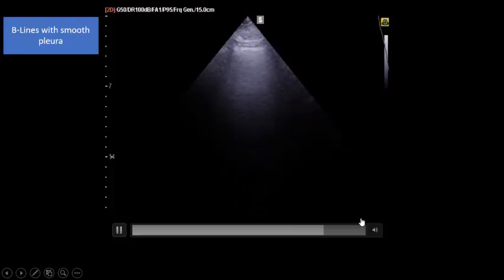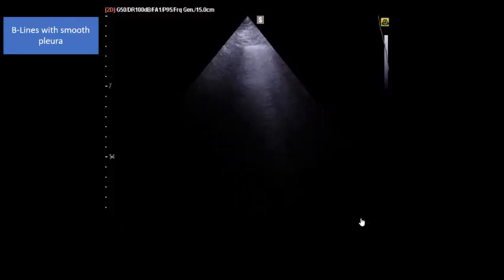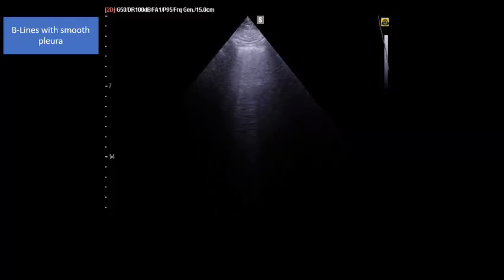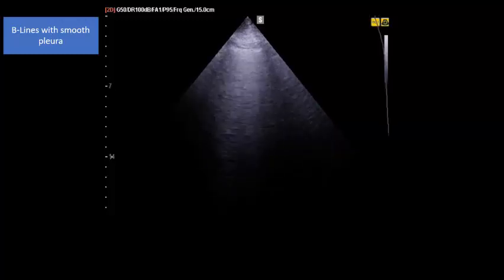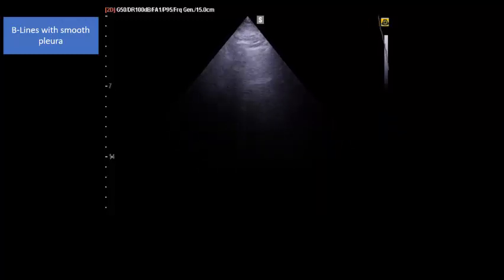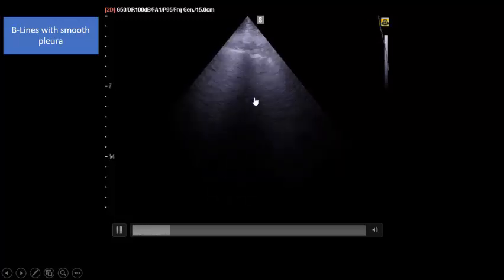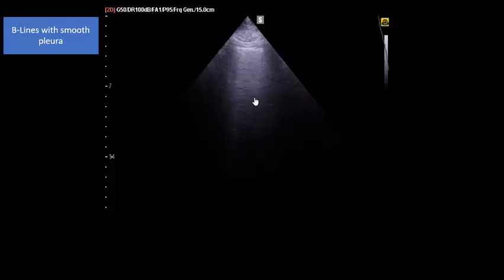As you see, advanced critical care ultrasound is magic, and this is the way you need to follow if you need to do your logbook for advanced critical care ultrasound certification. You need to go in this sequence in cases of acute respiratory failure. You go beyond the pathogenesis to diagnose the cause, and you see the pulmonary congestion yourself. This is the integrative approach between echo and lung ultrasound.